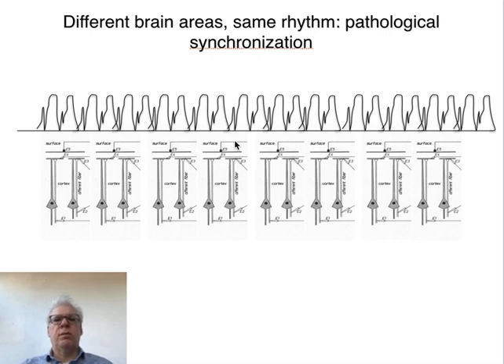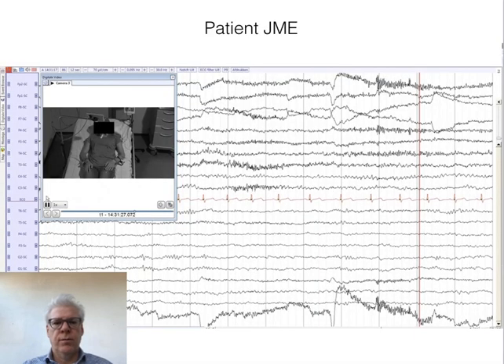And that is one of the reasons we make EEGs in patients who may suffer from epilepsy. We basically search for the interictal discharges. Now I will show you a few examples of patients recorded in our clinical neurophysiology department that show some of those interictal discharges, and in some patients even some seizure activity is shown. So this is an example of a young patient.